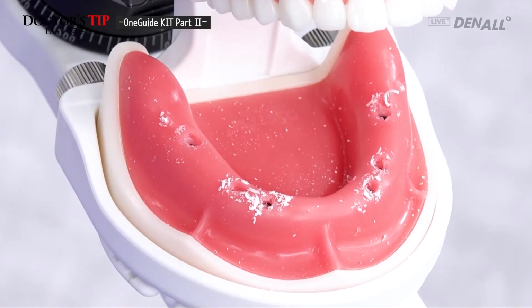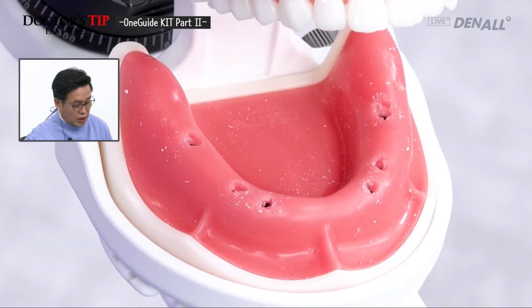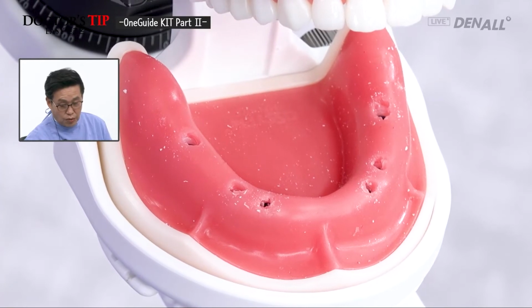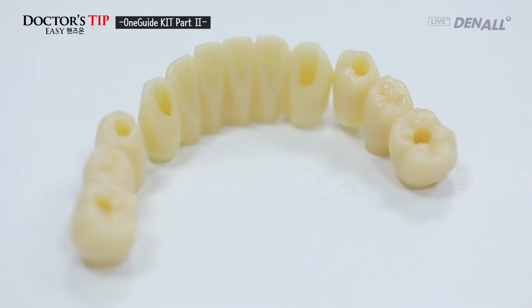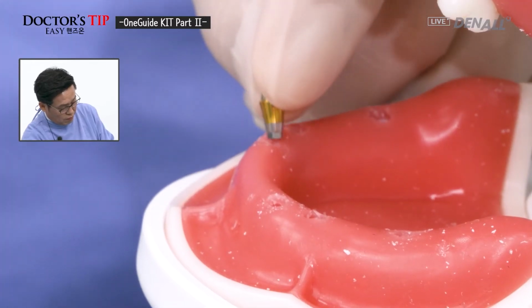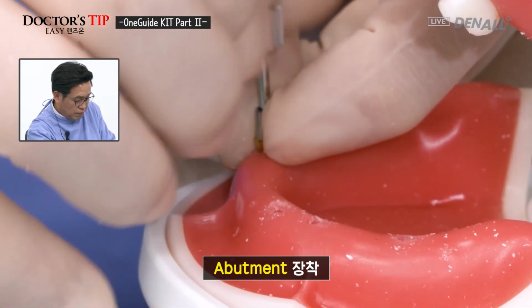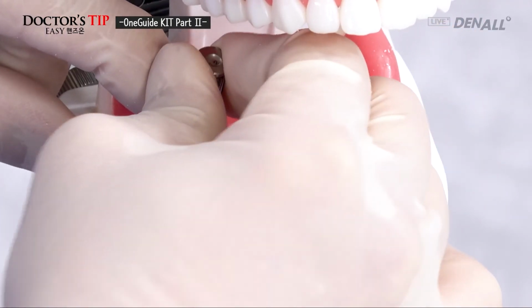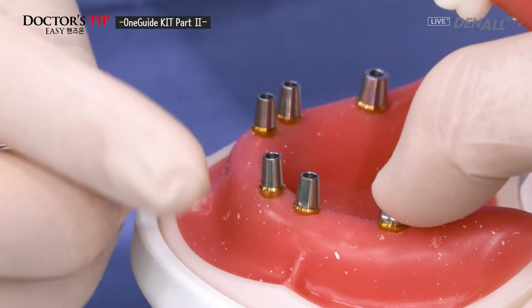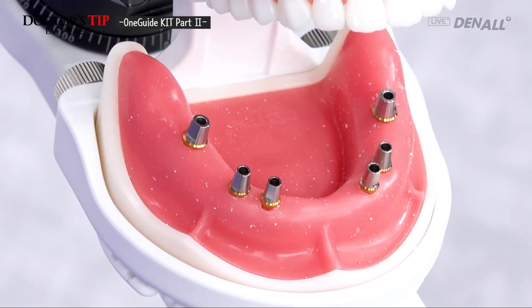If you look, the desired number 30 and 40 on both sides, canine, premolar, and first molar, they have been placed with implants. Now I'm going to connect prefabricated abutments and prosthesis. Hex control is done, so accordingly, as shown. So 6 have been connected.